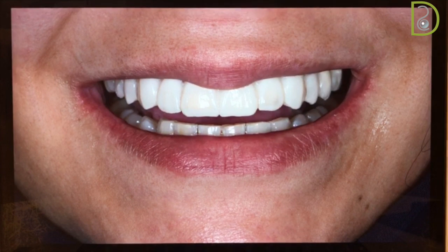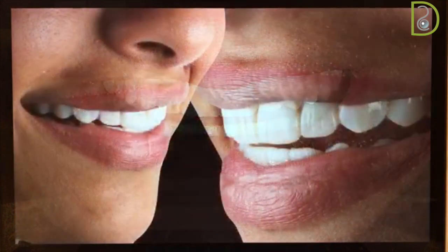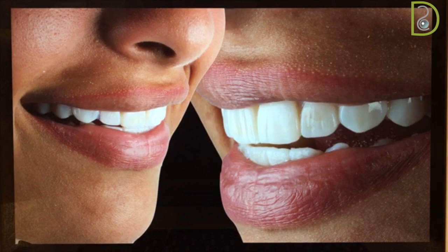We also need to mention to the patient that the final restoration will be a little bit different in terms of material, shade, and definitely texture, since we're going to be using ceramics by the end of the day. But definitely the technician will use this as a guide for your final restorations. So this is the mock-up. The patient is happy, she's satisfied, you did all the adjustments that needed to be done, and you go ahead and start.